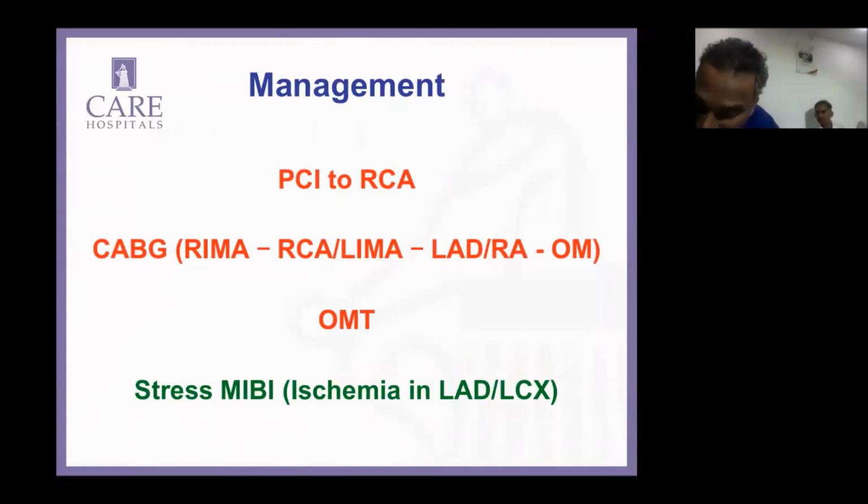Yeah, as we already discussed, coronary anomalies are definitely one indication where we may have to end up doing a CT angiogram after conventional angiogram. But I would also say there is a method to fish the coronary. If you are not getting a left coronary, first give a left sinus injection in LAO.